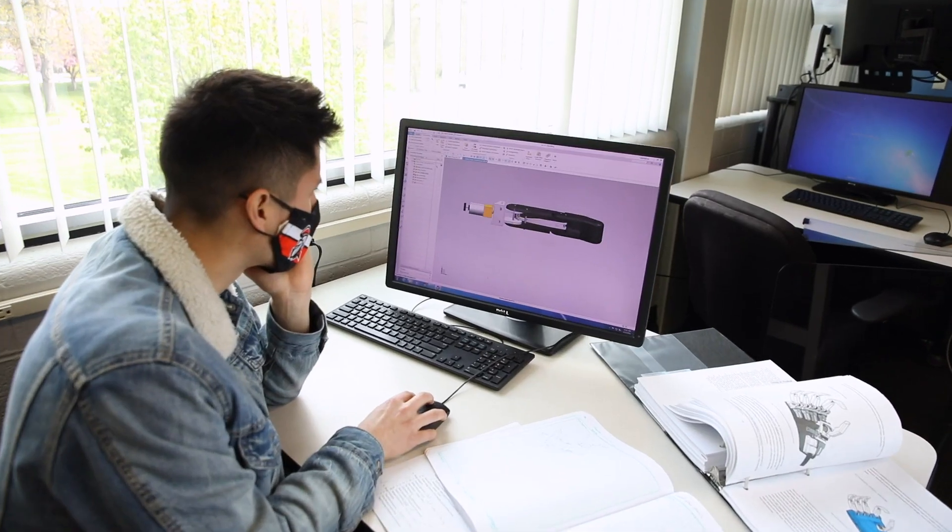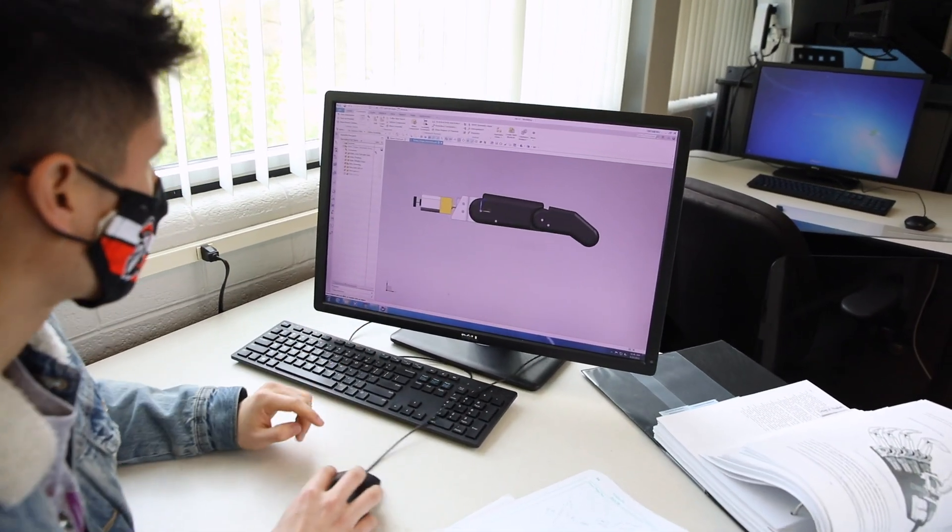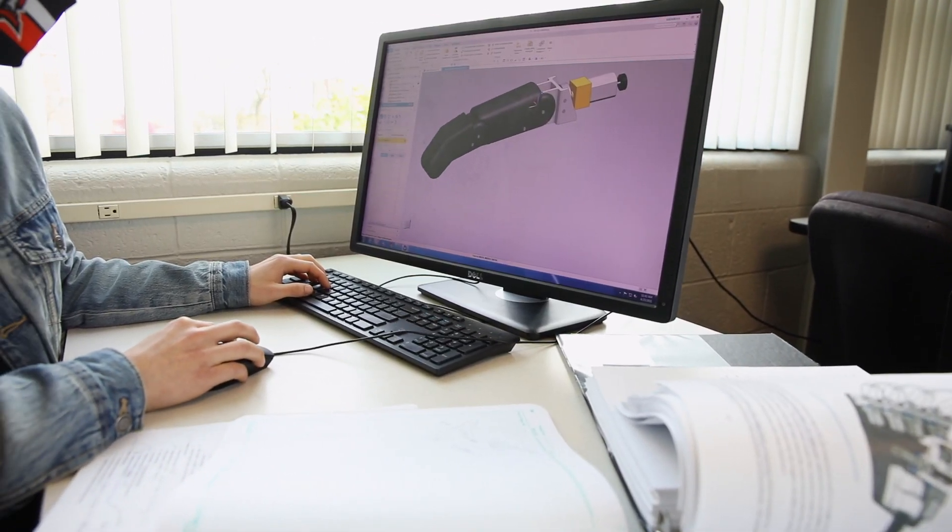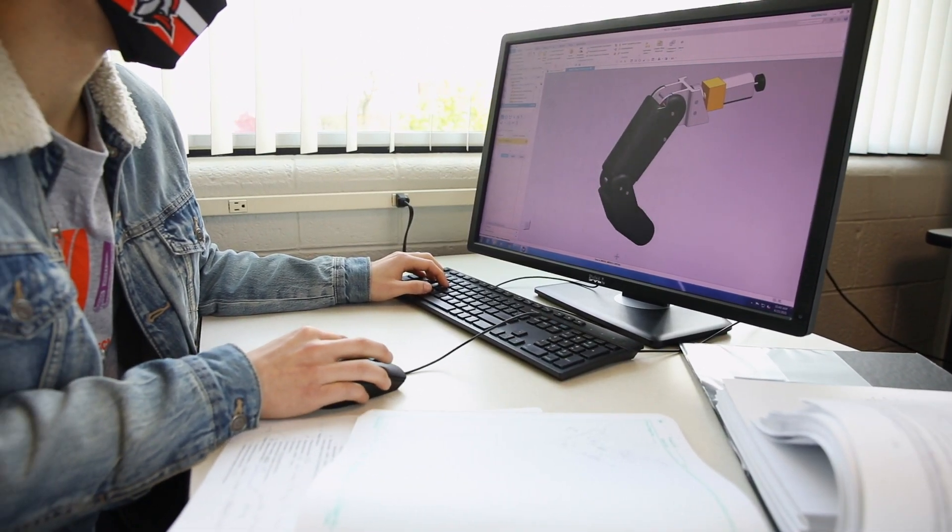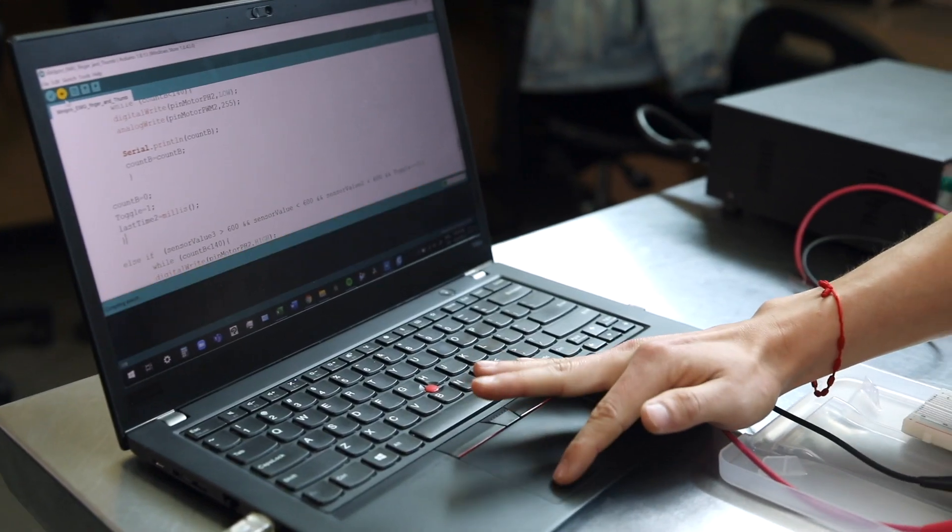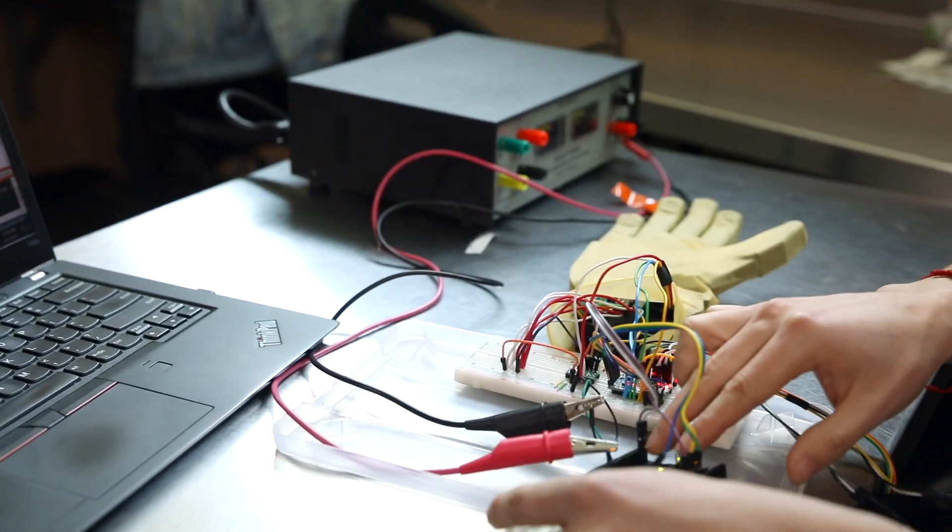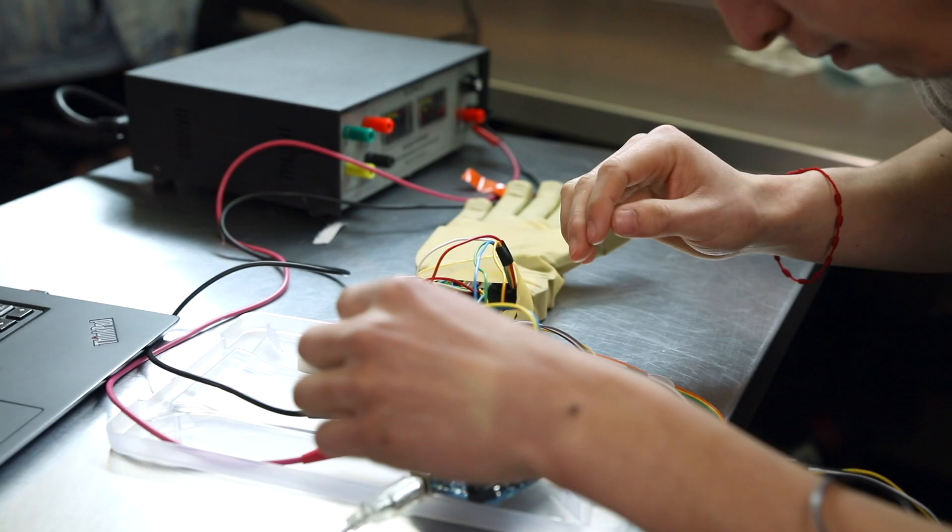To start designing my hand, I started with the finger mechanism, the mechanical part. Once I got that part working I started on the electrical part, and then the electrical part comes along with the programming part because I had to use motors to trigger the finger mechanism.